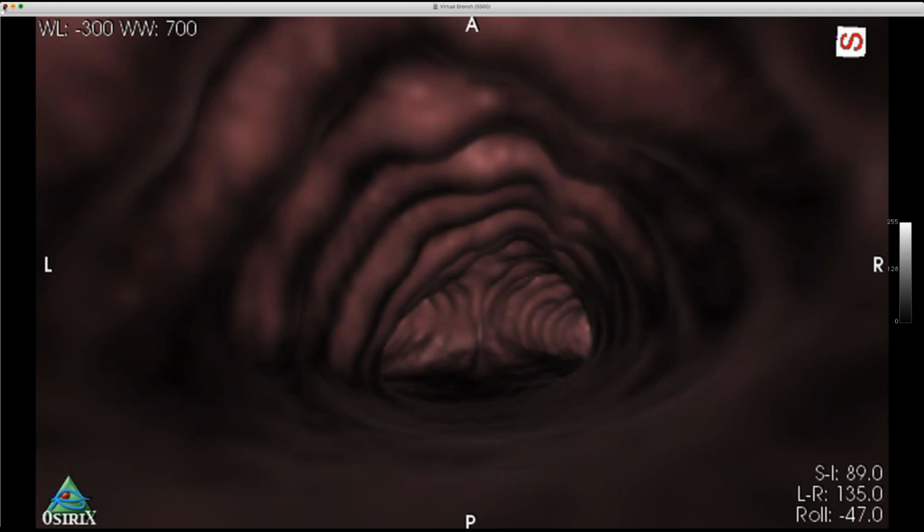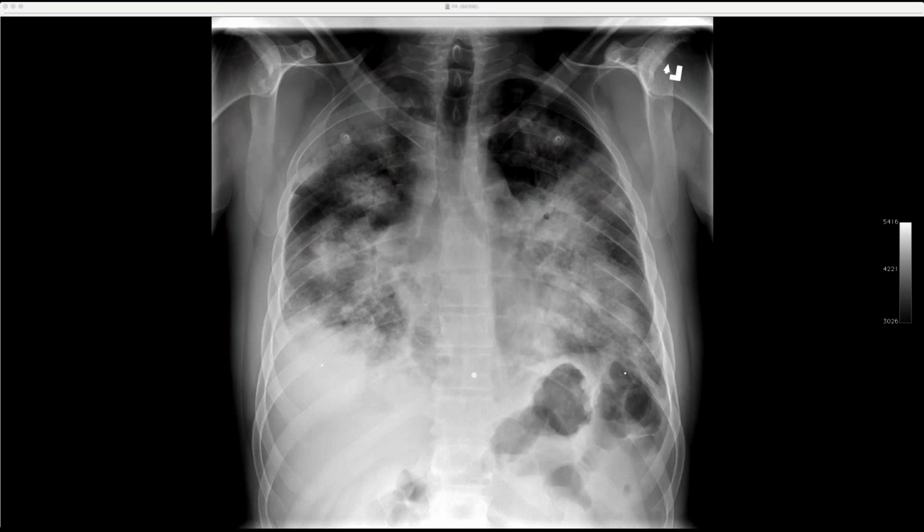But not associated with calcification or bone or anything within them? Just not in this particular one, no. Was this a male or a female? I didn't see on the... It was, let's see, it was a male. No, I take it back, it was a female. Do you think that TPO is more common in females? I think it's more common in men, but women, in my experience, women tend to calcify their cartilage earlier and more frequently than men. Right. Same with the ribs. Yeah. For whatever reason.